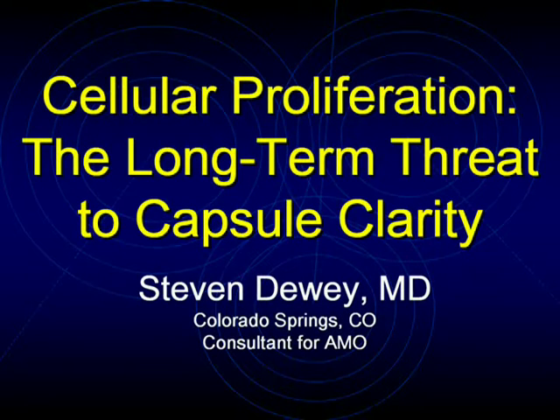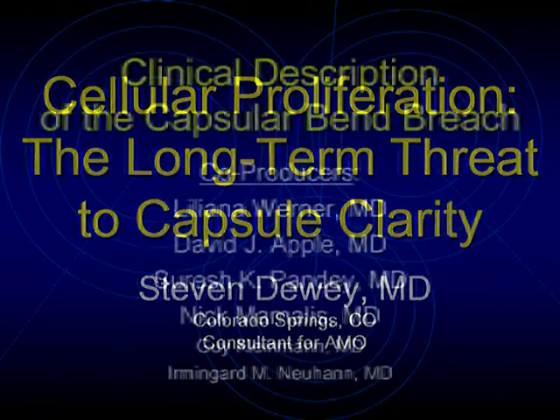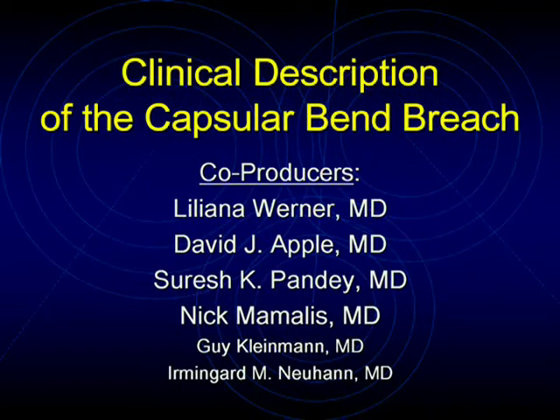Cellular Proliferation, the long-term threat to capsule clarity. Steve Dewey, Colorado Springs, Colorado. Subtitled, The Clinical Description of the Capsular Bend Breach.